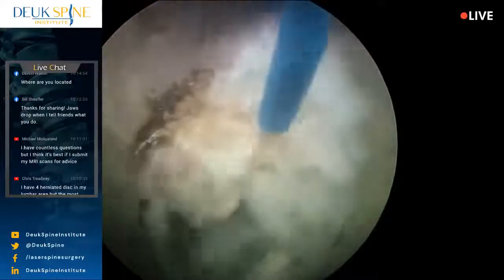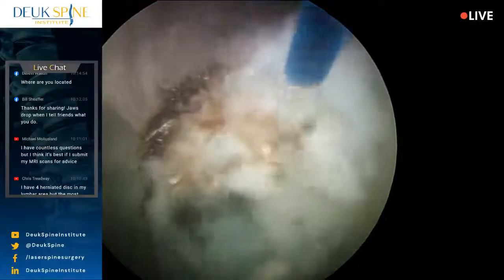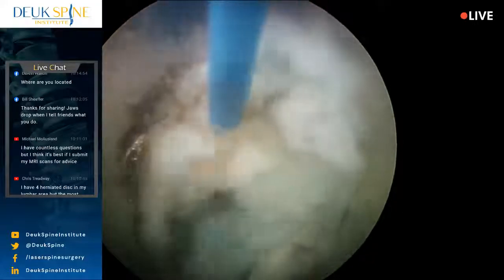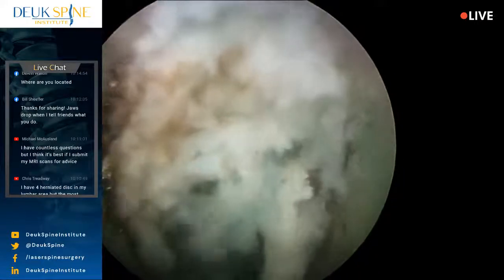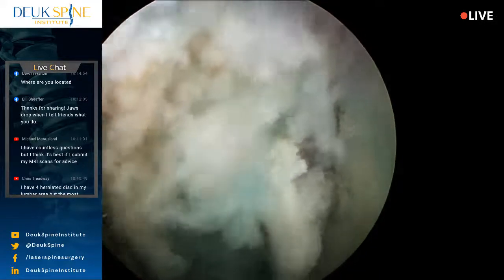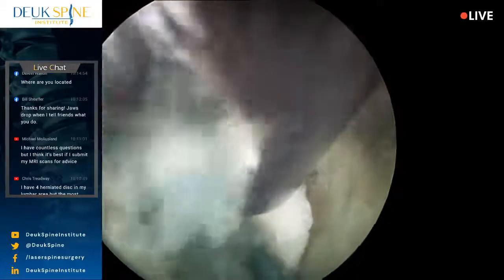So the nerves that we're protecting are just outside the tube, and that's where we want them. We want them outside the tube. We don't want them in here where the laser is. The laser could do a lot of damage to those nerves if it zapped them. And the nerves I'm talking about are the nerve roots.